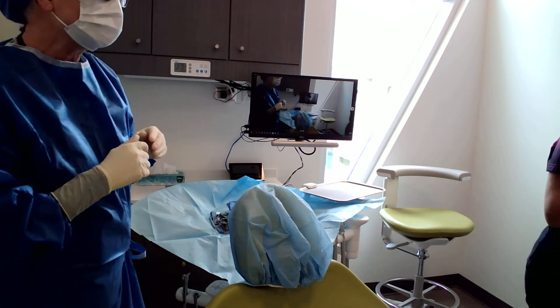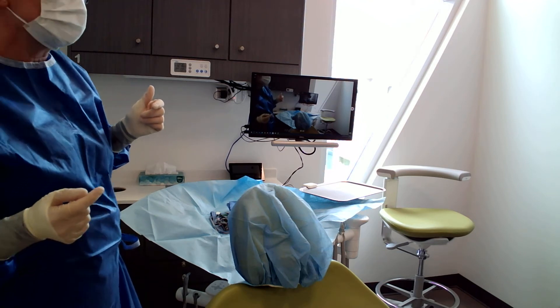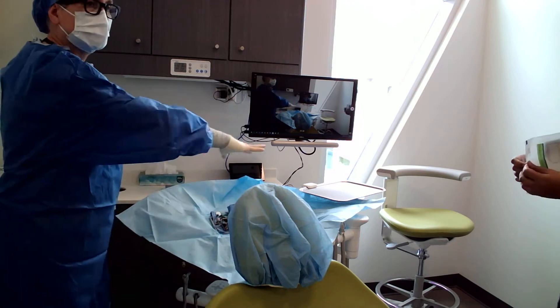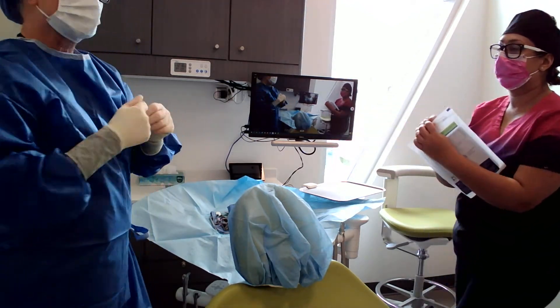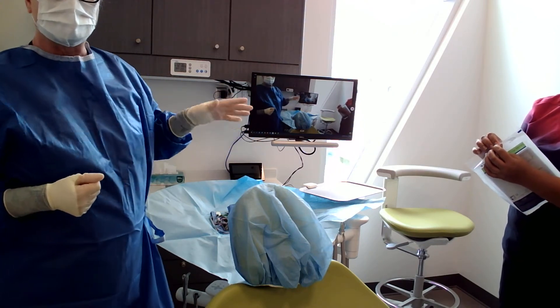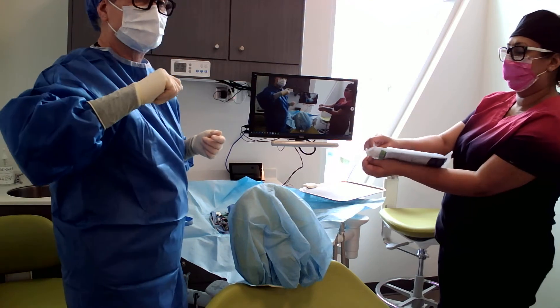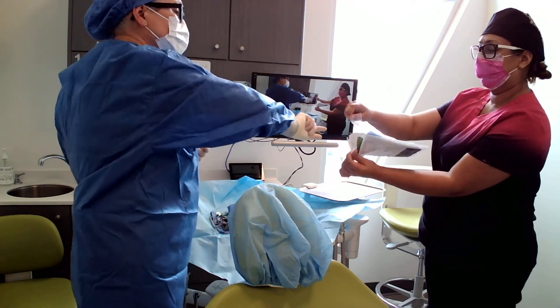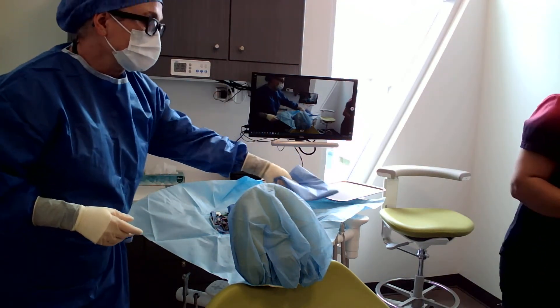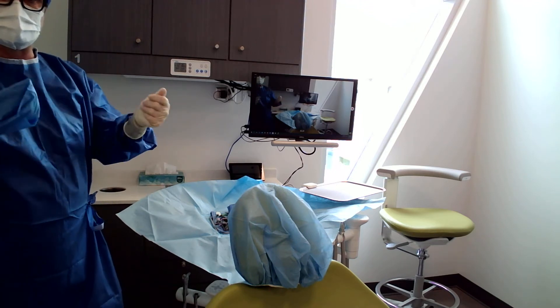Nina, I'll get you to open me right on top there — just clean hands. So what I want to do now is expand my sterile field. If I was by myself, I would have opened and dropped onto the sterile field, which you sometimes have to do, but it's not ideal. Best practice is me scrubbed in, Nina open, and I grab out — then there's no potential for me to drop this.